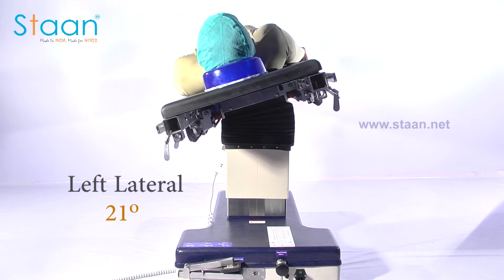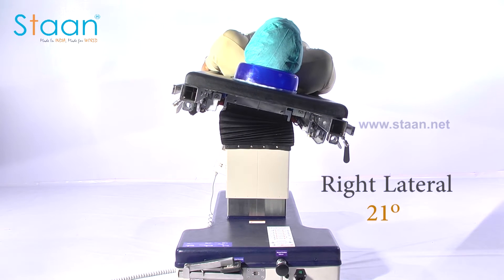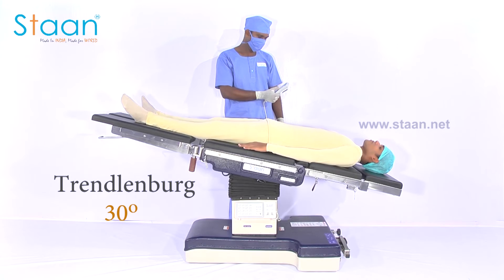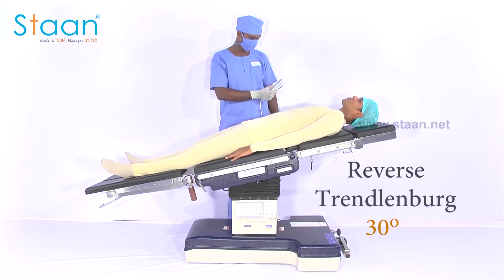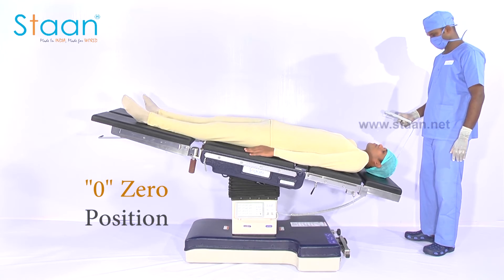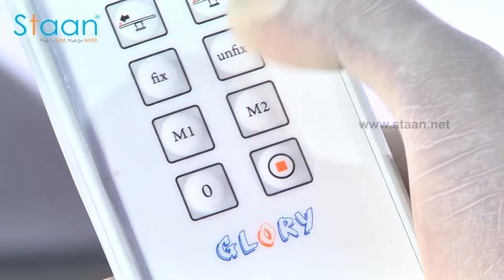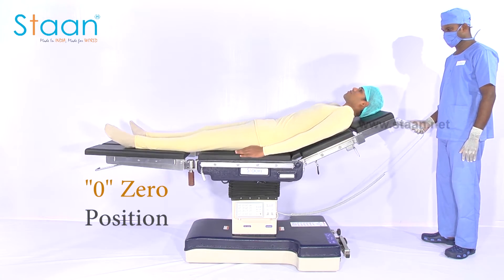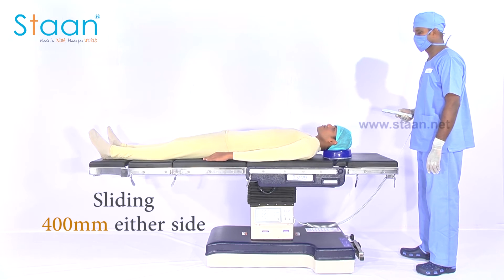Left lateral tilt and right lateral tilt of 21 degrees. Trendelenburg and reverse Trendelenburg of 30 degrees. A zero position is also present to bring back the tabletop to a flat position. The tabletop can be slid up to 400 mm on either side.